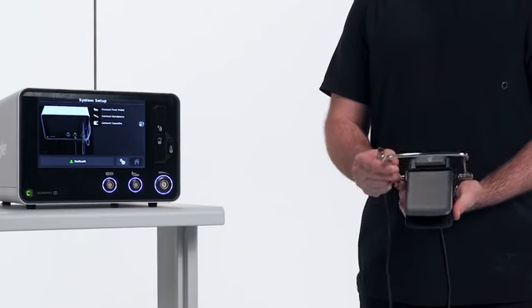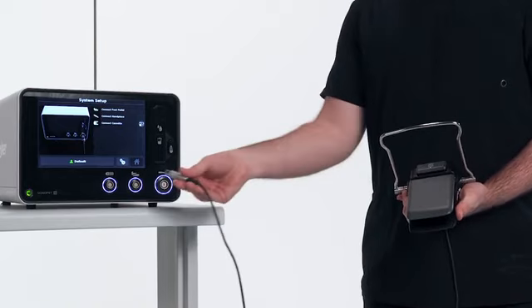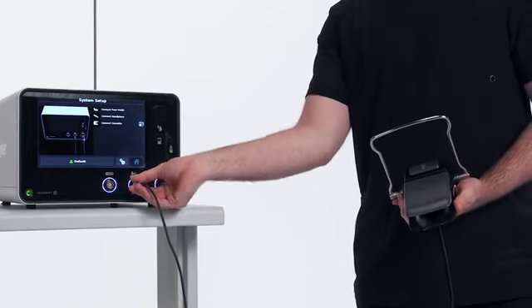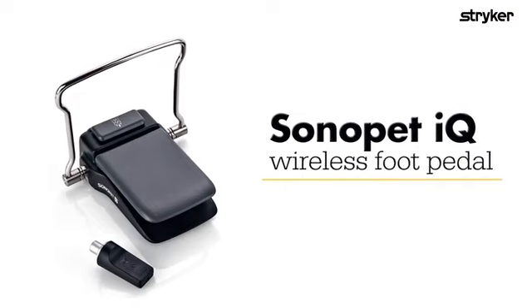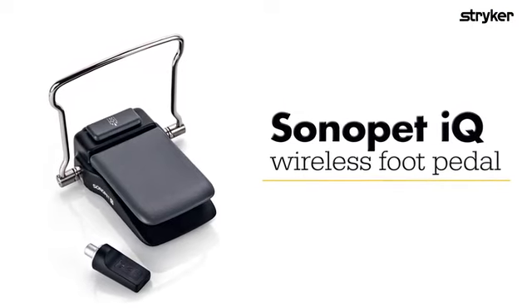Using a wired foot pedal, install the foot pedal connector into the foot pedal port. Ensure the foot pedal port indicator is solid green on the console. If using a wireless foot pedal, please refer to the IFU supplied with your Sonopet IQ console.